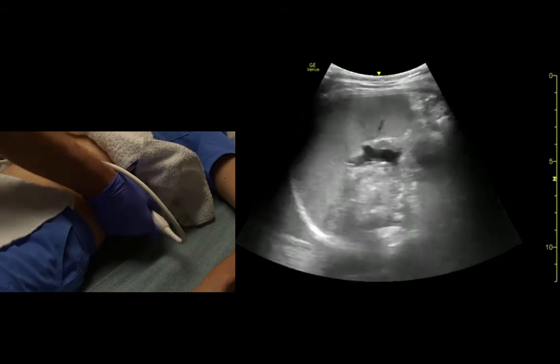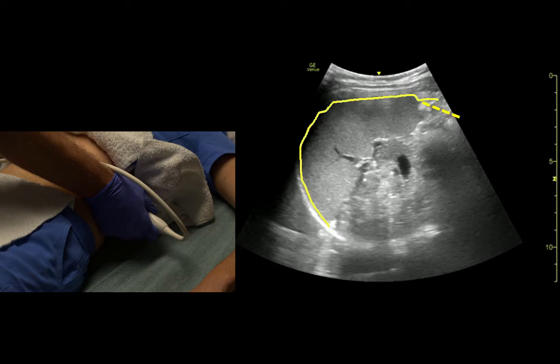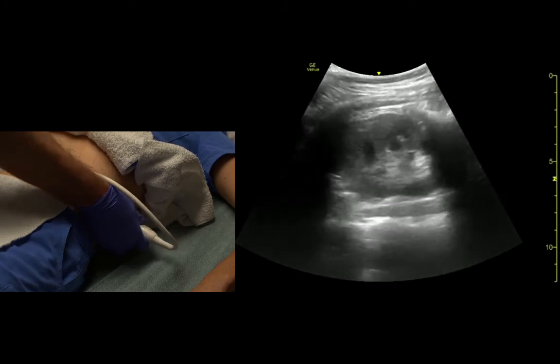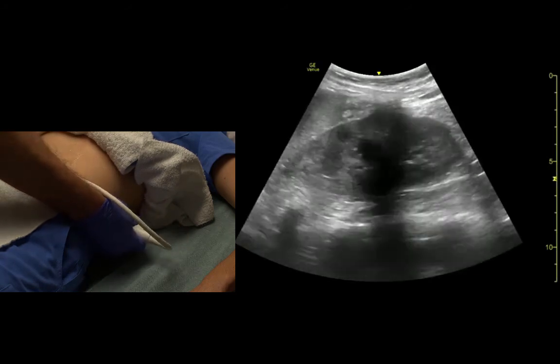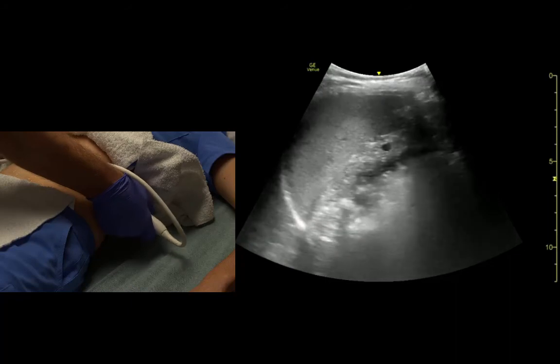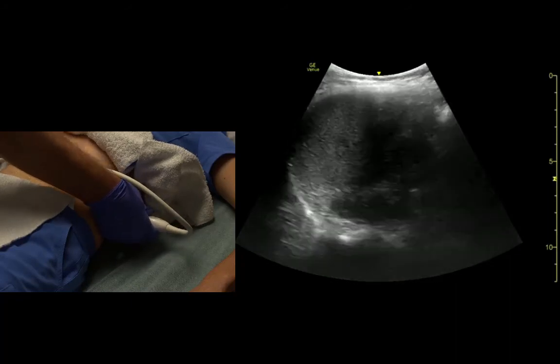The spleen is all uniform texture, fairly small, about the same size as the kidney. And we can see the spine bumps behind the kidney.